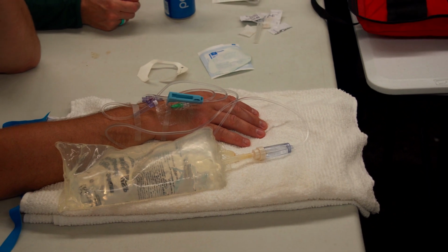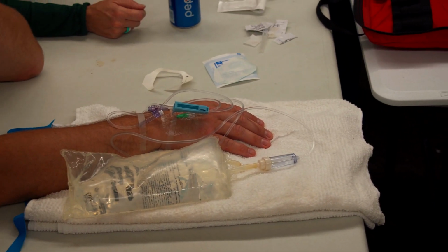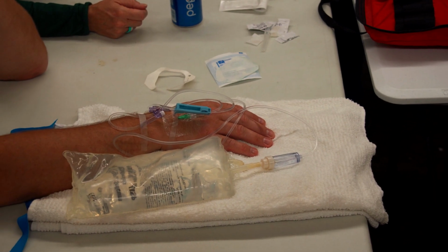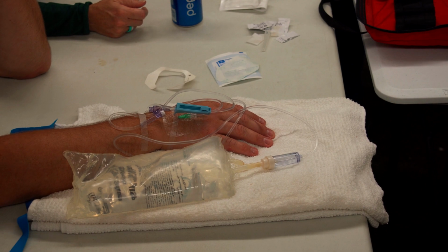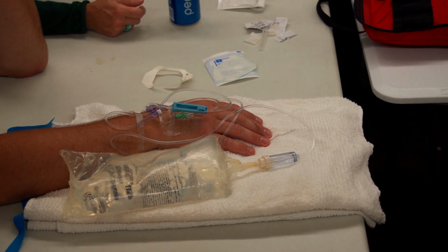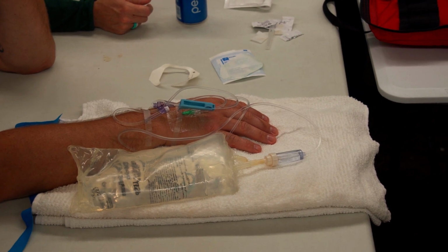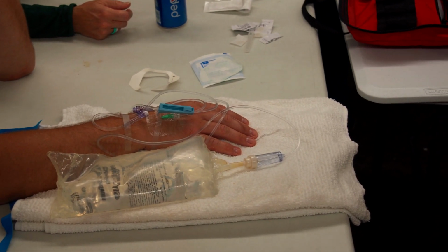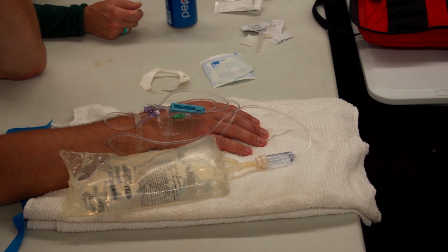Okay, great. So our cots have poles on them, and then there are hooks in the ceiling of the truck. We have Velcro on those hooks too that you can use to squeeze the bags, like you said, when we switch from our cot over to the helicopter cot. A lot of times it gets laid between their legs just for a few minutes until we get all that reset again. That's part of crew resource management and that idea of clear communication. So, okay, I'm clamping this off, great, clamped off, so now they know that it's clamped off and they're ready to go again.